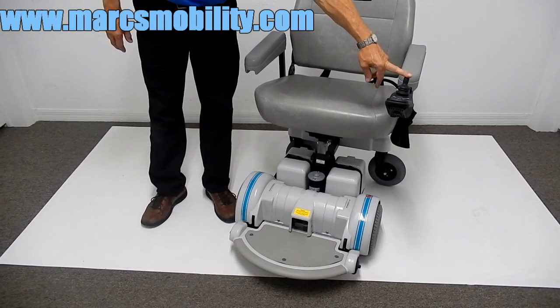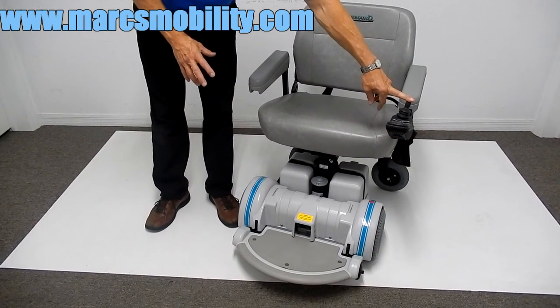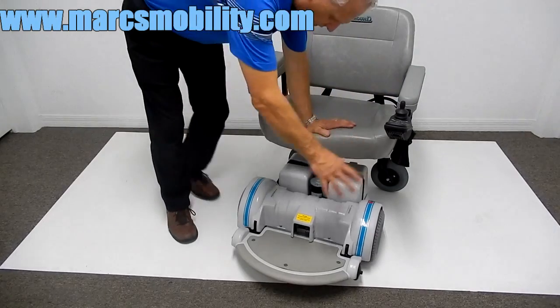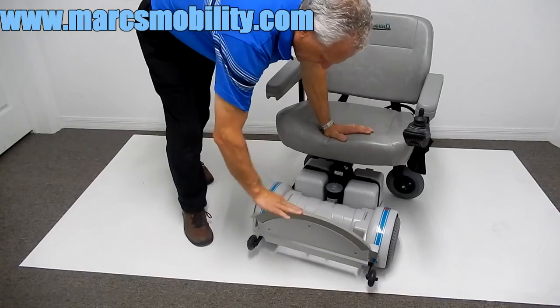This power chair is almost in new condition. As you can see by the tires, they're practically brand new. The foot plate is here, and you can flip the foot plate up for easy access.